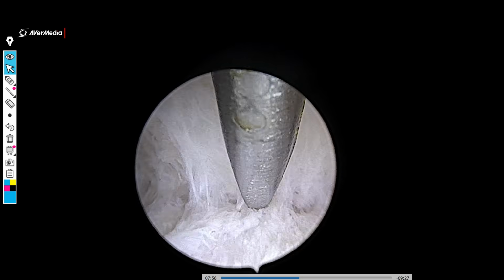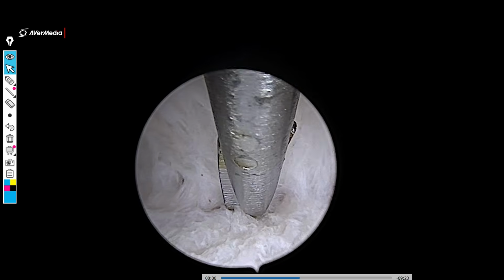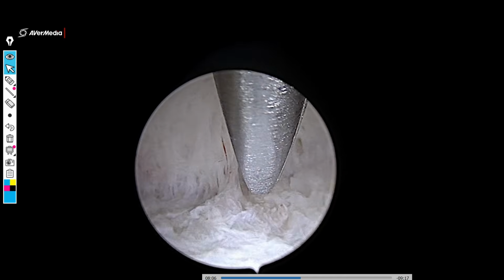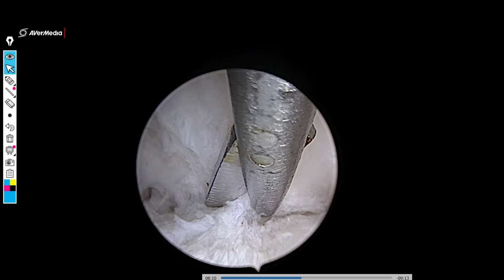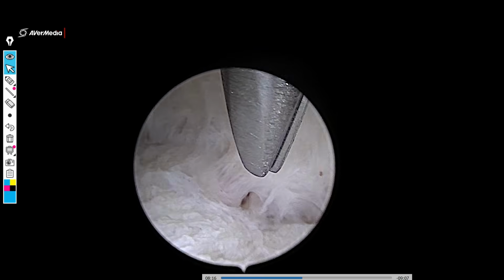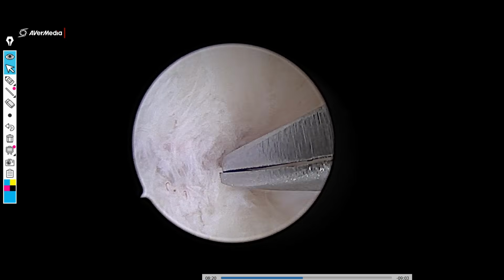But here you can see now we are working on the left side of the patient and trimming up the synechia so as to reach the level of the tubal ostium. Here you can see that last cut resulted in exposure of blood vessels. So now I have to be cautious, which means that I'm probably closer to the myometrium, which again, like I said, is a good sign. But neither of the two signs can be considered absolute.